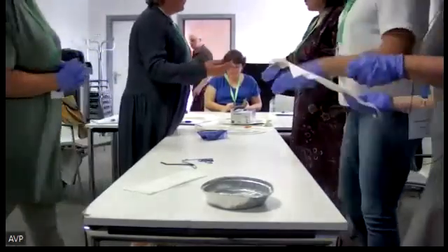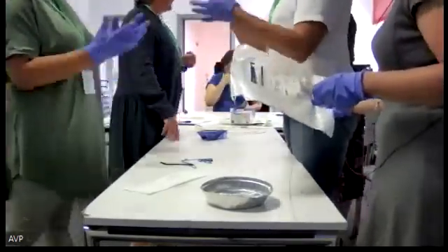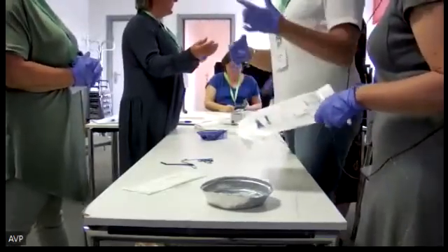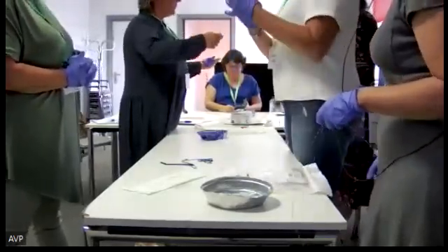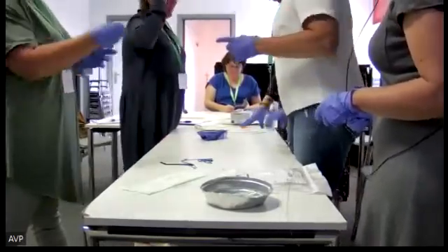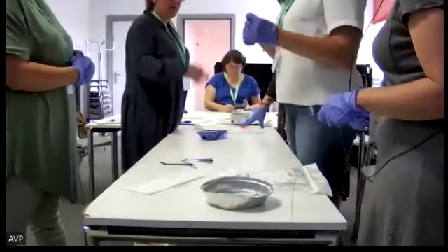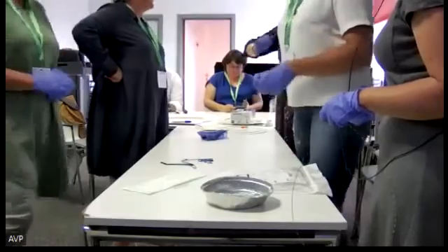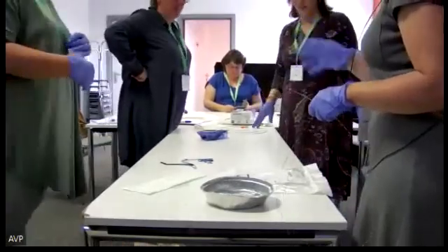Because we have two hands, ten fingers, but the doctor also. And so if Diana has the scope in her hands, she can put the wire. Yeah, we saw that. So it's better.